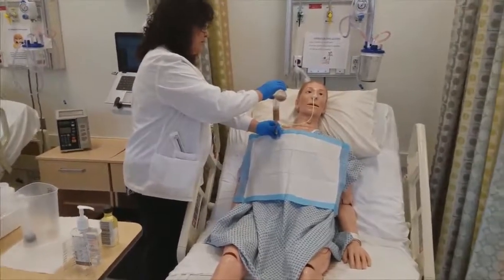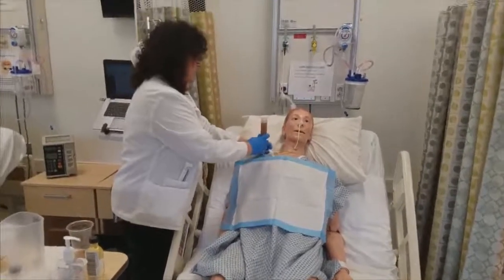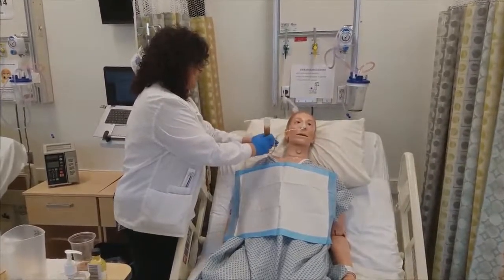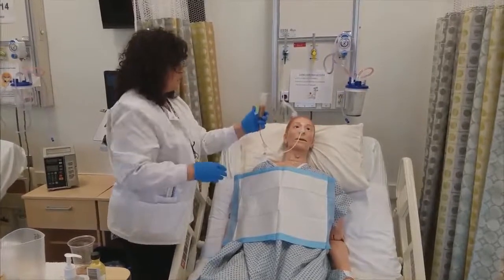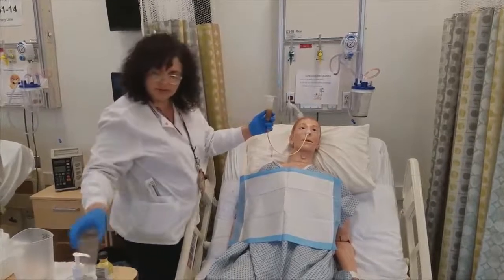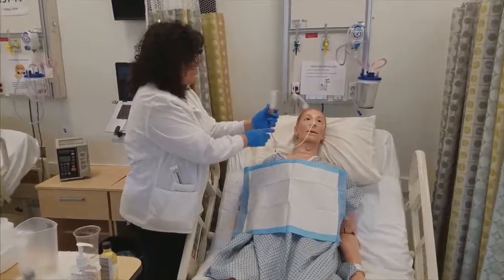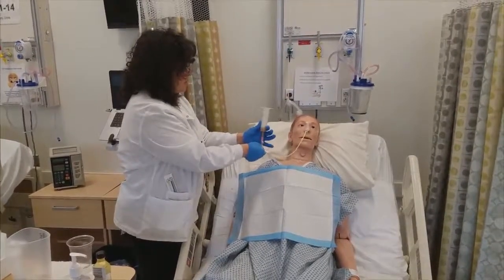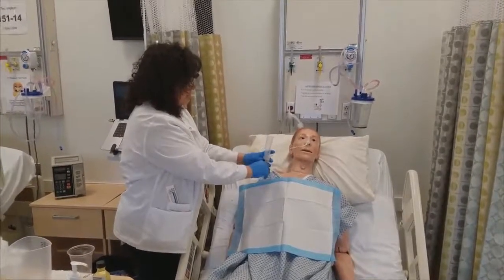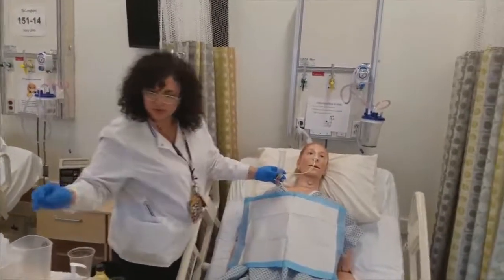And for that, I'm going to funnel it in. We can unpin it just to give ourselves a little more latitude. So we'll let that go. We'll try to prevent getting gaps of air in between the liquid, just for patient comfort. It's a good idea to hold the connection so it doesn't come apart. When it gets down into the tip, we're going to go ahead, lower it and clamp, and then I always want to follow this with a flush of water.